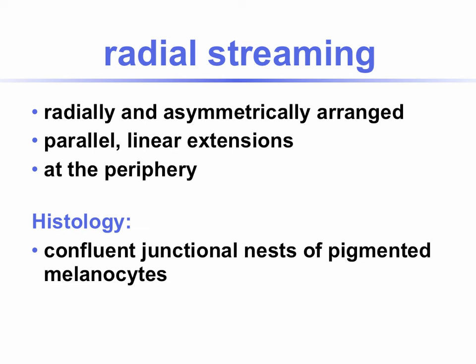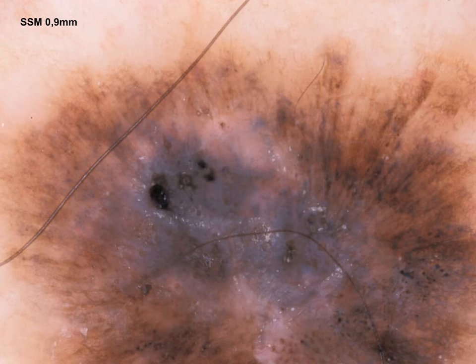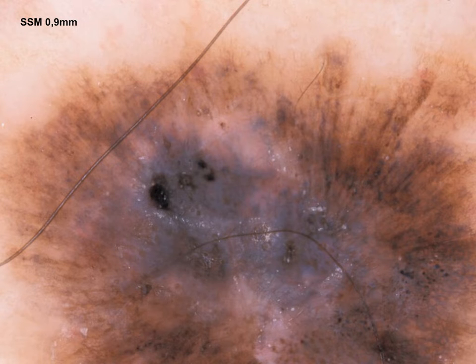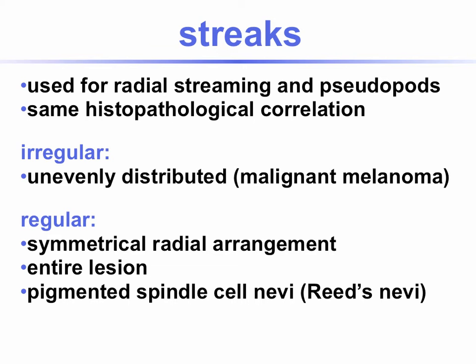Radial streaming. These are radially and asymmetrically arranged parallel linear extensions at the periphery of a lesion. Histology shows confluent junctional nests of pigmented melanocytes. In the case of a melanoma of the lower leg, dermoscopy shows dark streaks oriented towards the periphery, especially in the right upper part of the lesion. In the center, you see blue-white veil, irregular blood vessels, and atypical dots and globules.